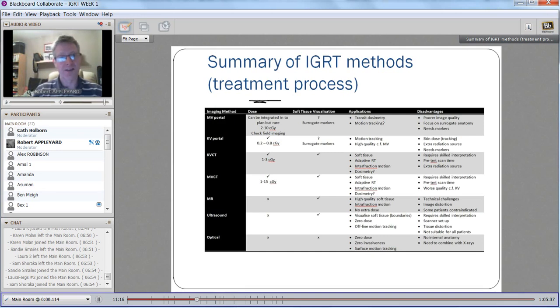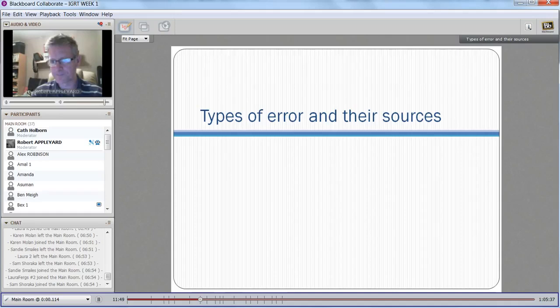And again, we'll look at that from next week in terms of the implications of dose in the pre-treatment arena. So, for example, with PET-CT, a number of people forget about the dose implications in PET, which can be quite significant, particularly because PET is used in follow-up to assess the response to treatment. Not really image guidance radiotherapy there, but the issue is that there are considerable dose implications. So we'll move on to that later on in the course.